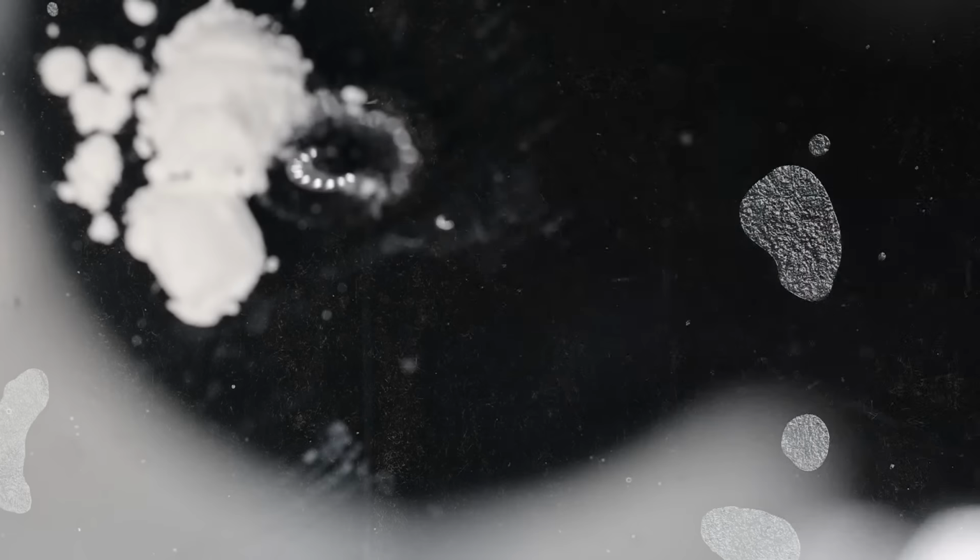Okay, so we have taken just 1.5 scoop, and we will use a drop of MTA liquid. Okay, so this much is sufficient.